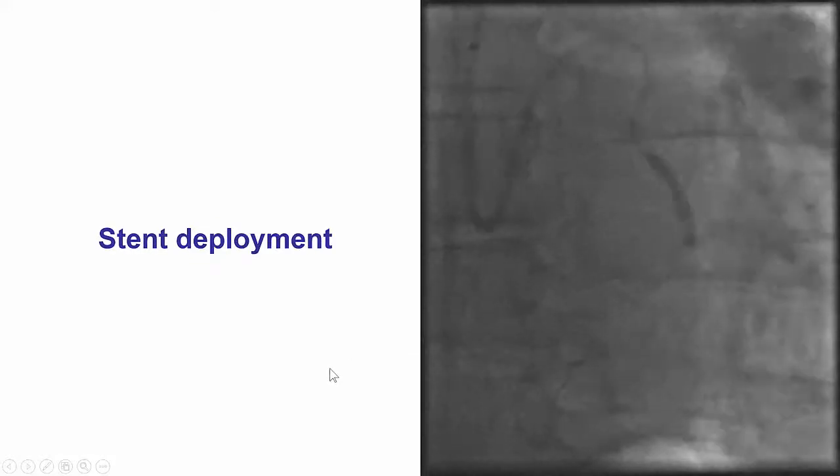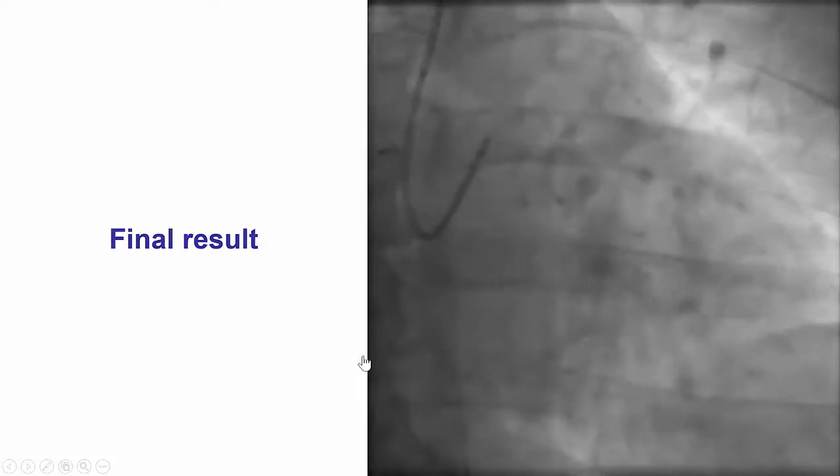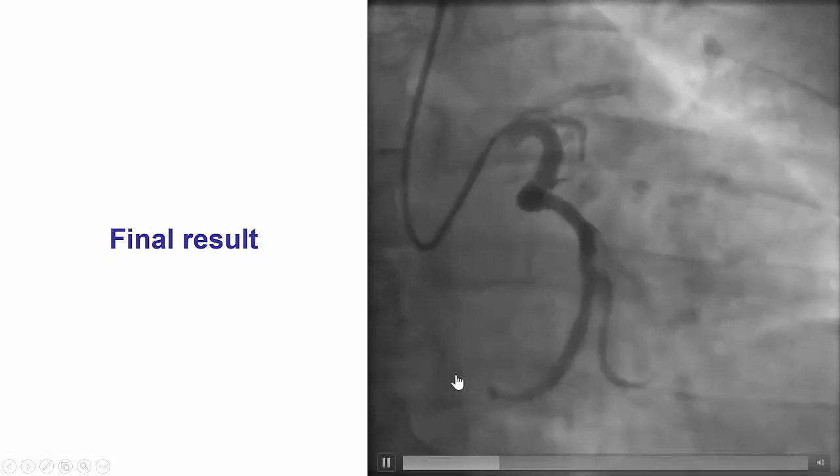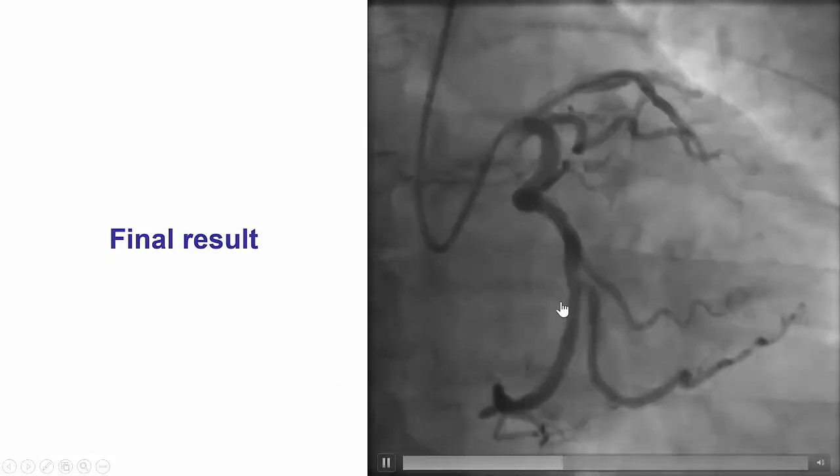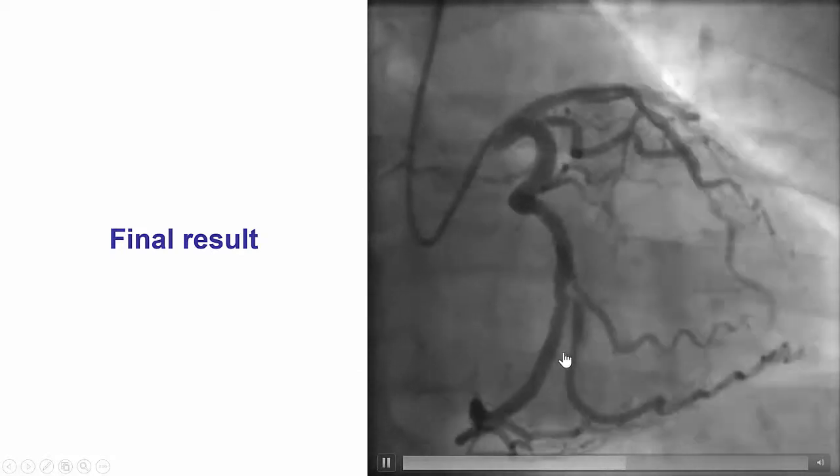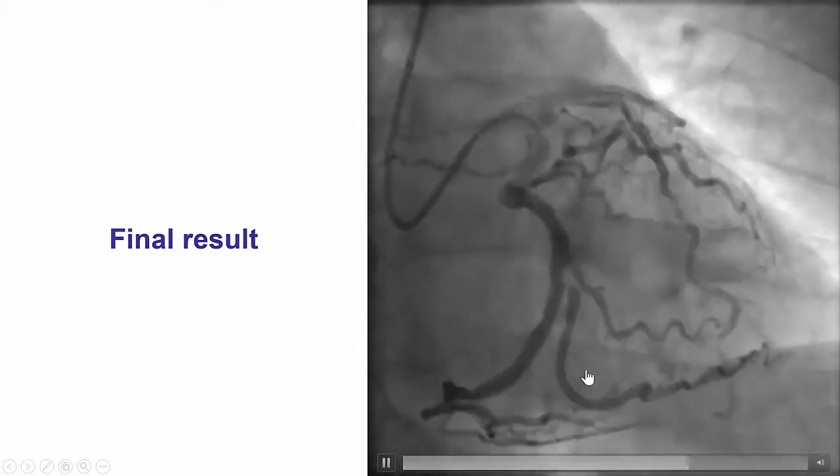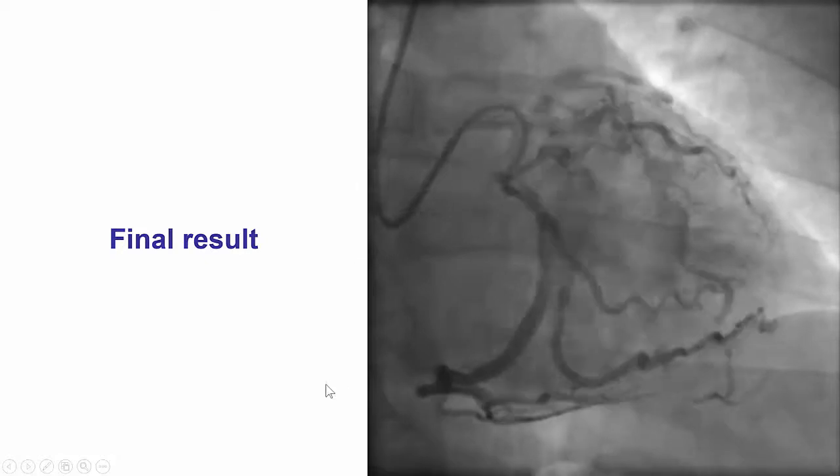After stent deployment, we had a nice angiographic result. Despite pinching of the ostia of both obtuse marginal branches, there was excellent TIMI 3 flow without significant lesions.